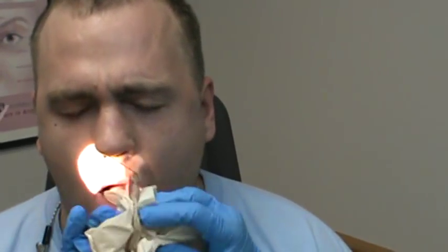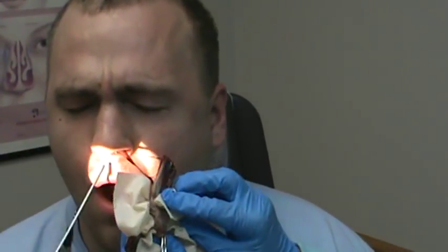Just keep your breathing, don't hold your breath. You're doing great. Good job. All right, here we go. And just one more. Good, good. You got it. You're doing great, you're doing super.